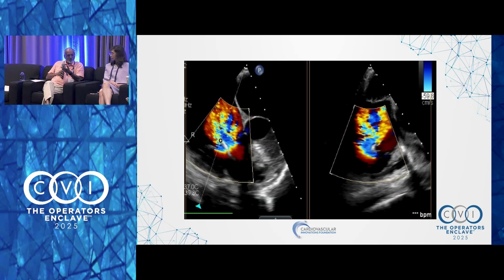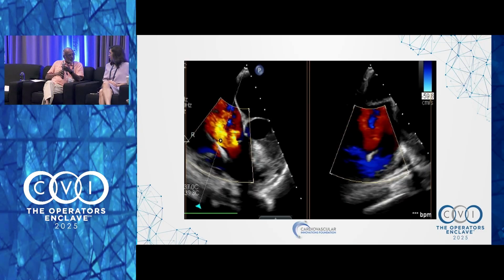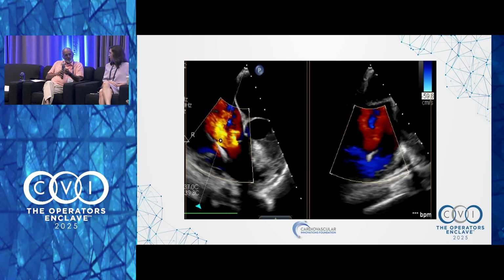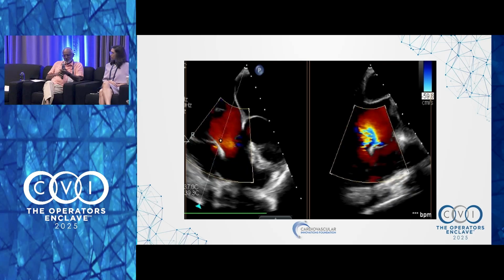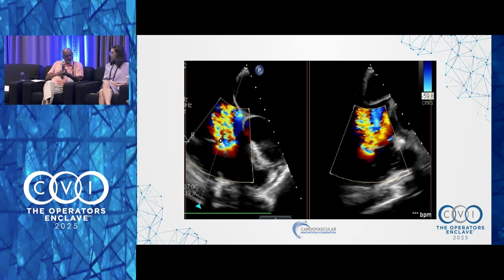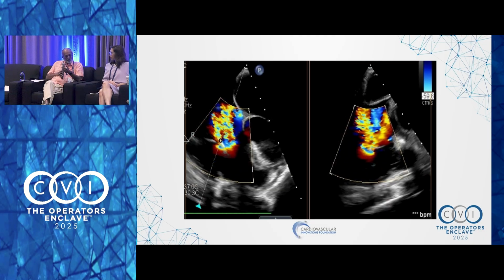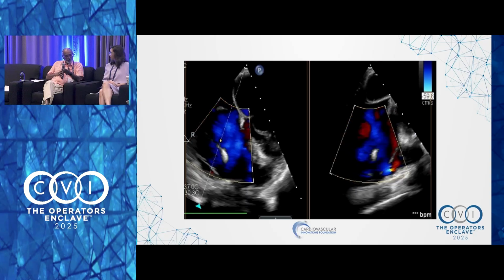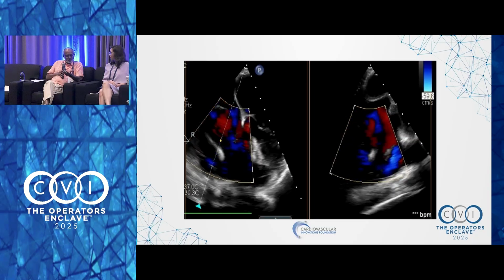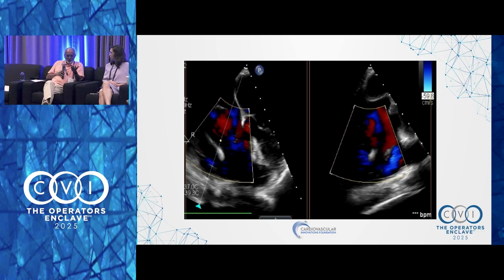For me, TTVR based on leaflet grasping is not the future. It has to be a valve that doesn't depend on leaflet grasping, because tricuspid leaflets are thin and they're often tethered, and it's hard to get around it, get beneath it, and actually make sure. In our initial experience, we ended up with some degree of PVL, and that PVL varied depending on what the interventionist asked me to call it. If it's mild, it's mild. And if they wanted it to be moderate, it's moderate.